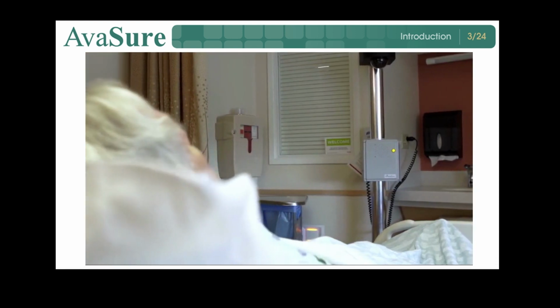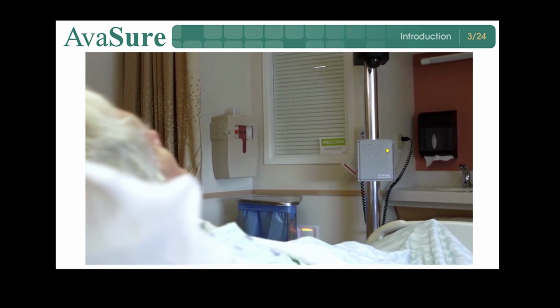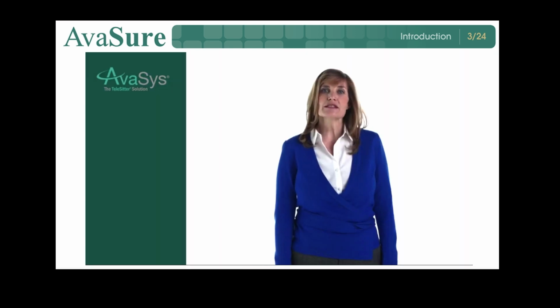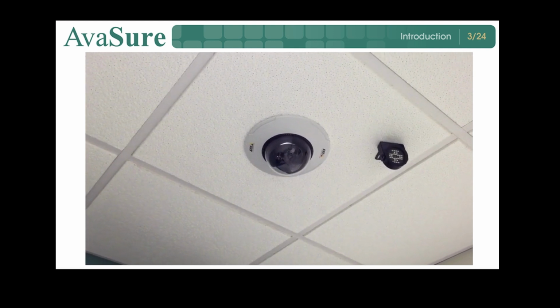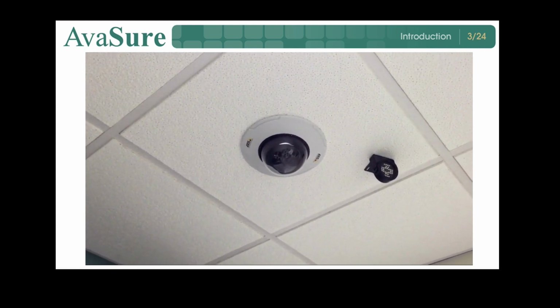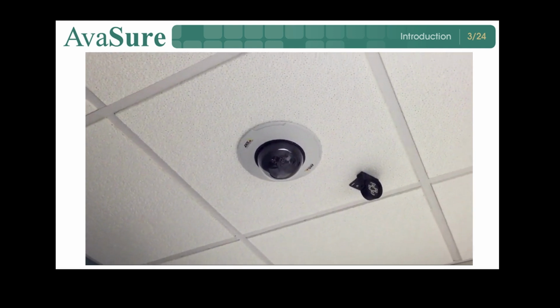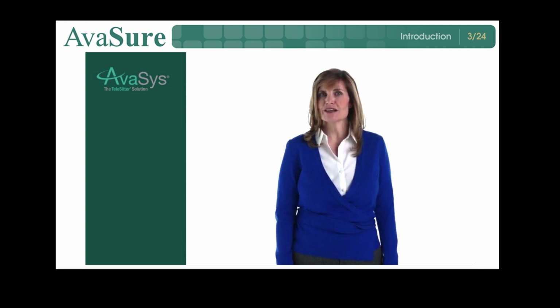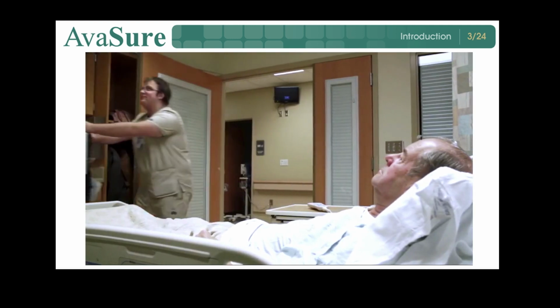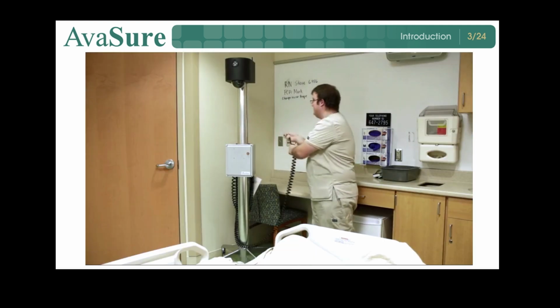In-room setup is comprised of 4 basic steps. First, if it is a permanent room system, a nurse will give the AvaSys observer the room number so they can activate the camera. If a mobile unit is needed, a nurse requests one from your facility's designated storage location. Next, the unit is placed in the room and plugged in.